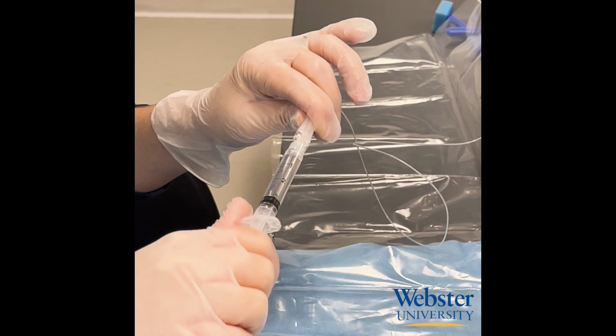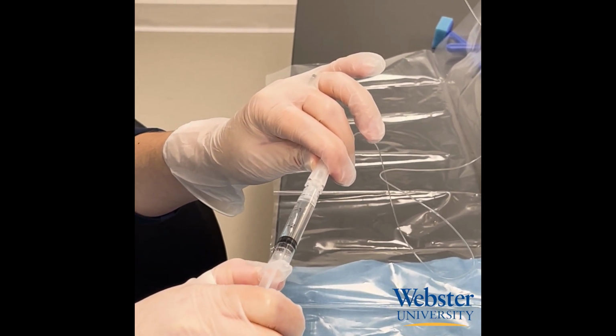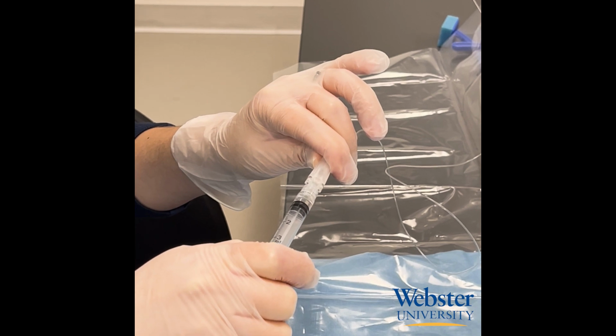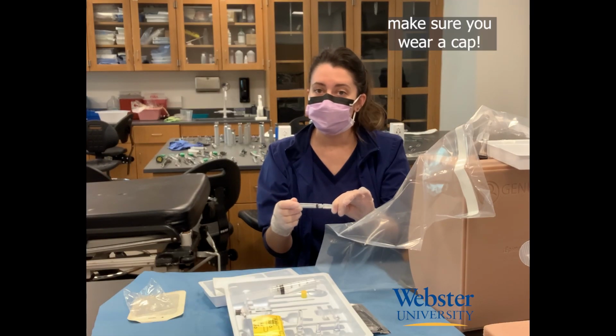The timing of the test dose is important. It must be between contractions in the laboring patient. This is because an intravascular injection will cause an increase in heart rate, but that might be masked by the pain of a contraction. As long as the timing is good and no blood or CSF is seen, you can go ahead and push your 3 mL of lidocaine.